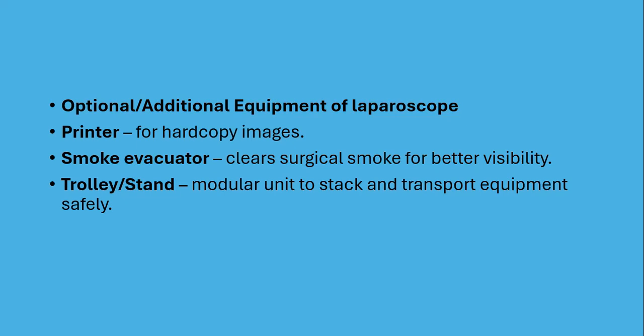Optional/additional equipment of laparoscope. Printer, for hard copy images. Smoke evacuator, clears surgical smoke for better visibility. Trolley/stand, a modular unit to stack and transport equipment safely.